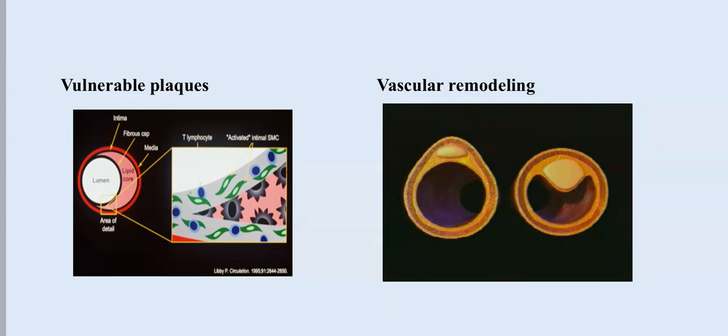And that's why cardiac CT has sensitivity, specificity and negative predictive value for any plaque approaching 100%, because it sees the wall. The cath lab, I mean the coronary angio, does not see the wall. It sees the lumen, and the lumen takes time to be narrowed by atheroma because of this vascular remodeling. But in cardiac CT, you could see the wall, so you could see even the extrinsic remodeling and all of that.